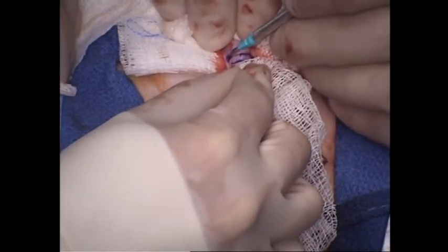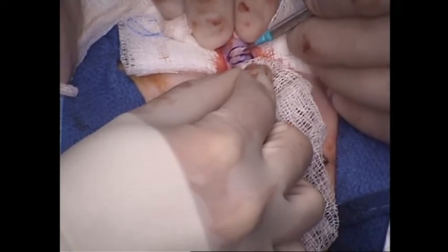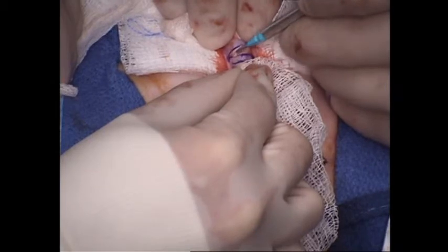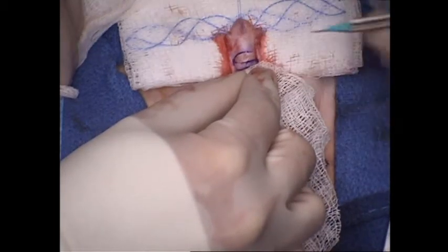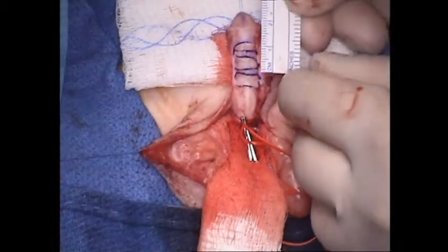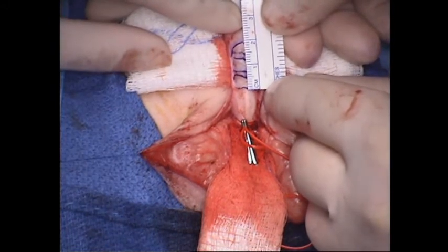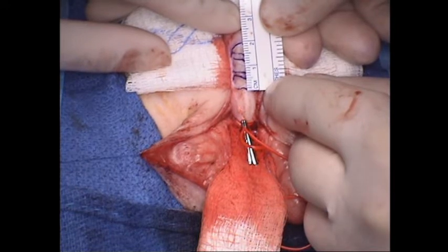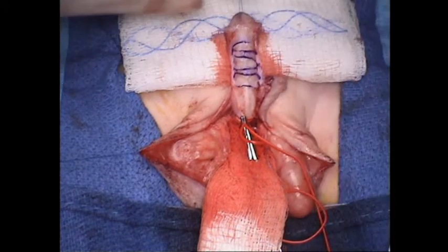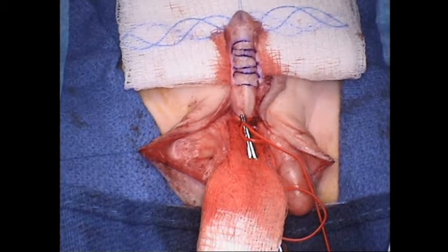We do three because we want some redundancy to the systems. Getting the penis straight is such a critical part, what we would consider probably the most important part of proximal hypospadias repair, that you want to have redundant systems in place. So you can see that we've stretched from 10 millimeters before up to 19 millimeters, with a gain of 9 millimeters, almost a centimeter in length.